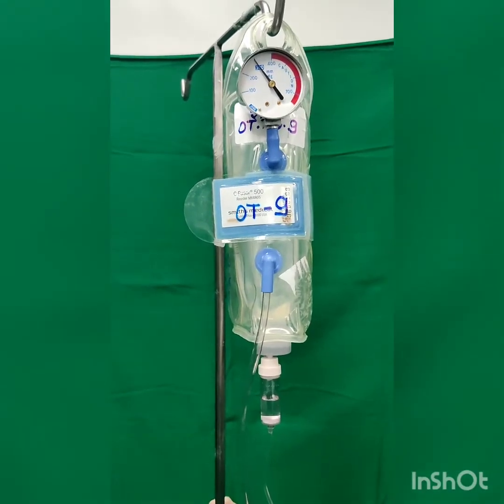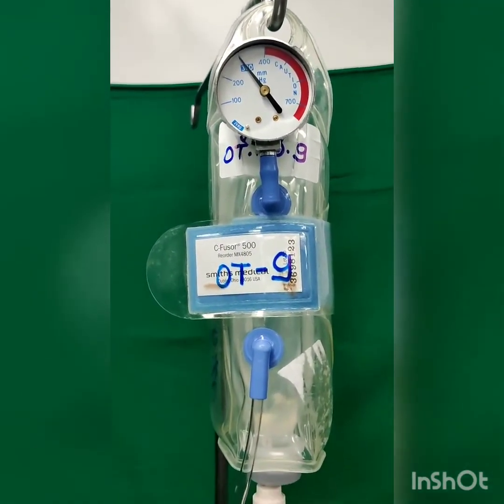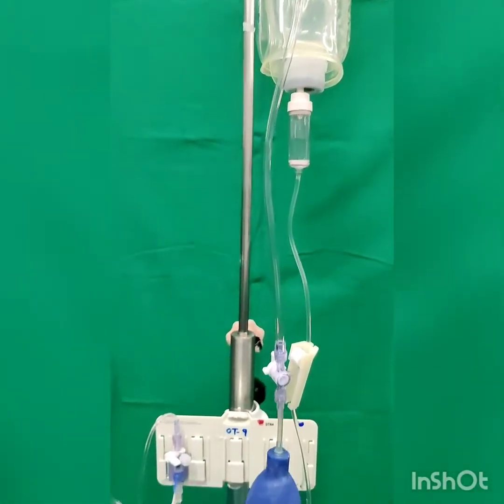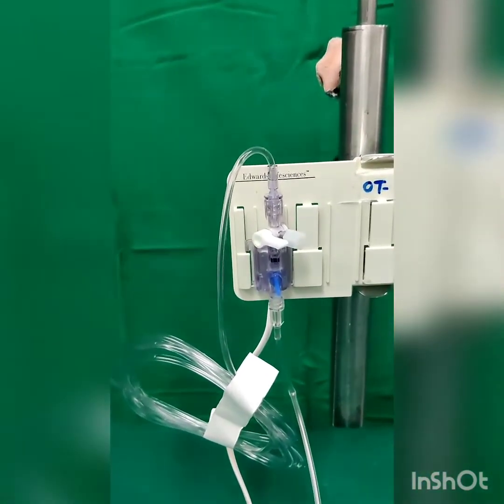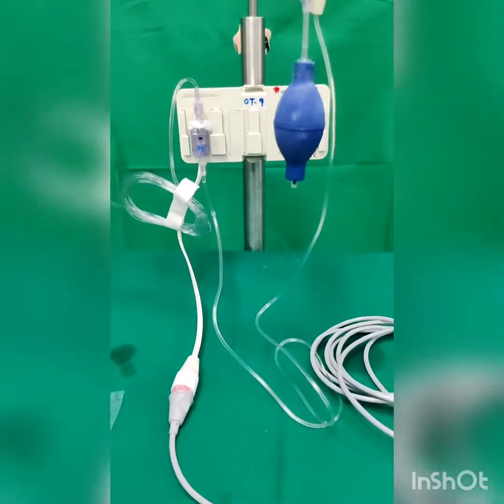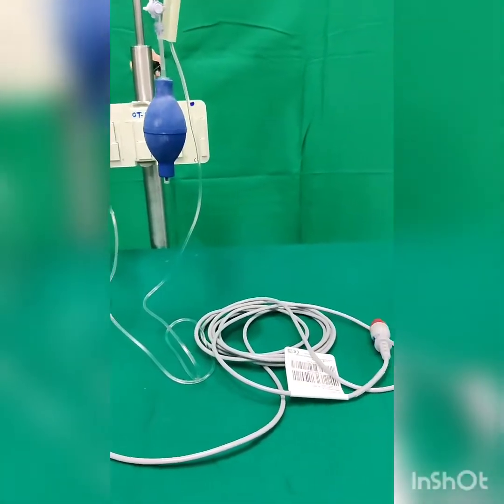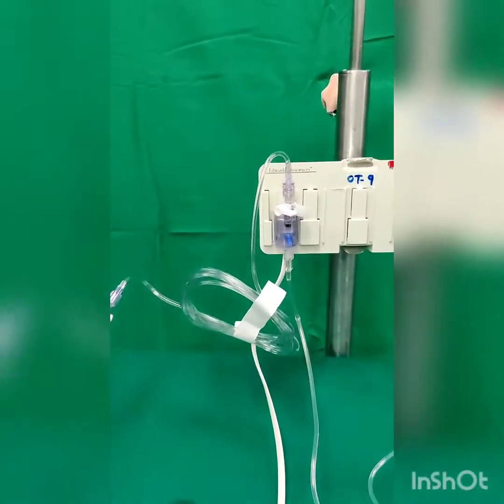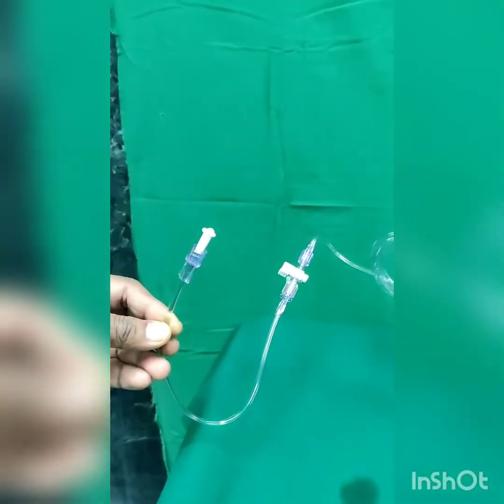The transducer setup has a 500cc normal saline bottle inside a pressure bag with a pressure of about 300 mmHg to prevent any backflow and to allow flushing of the catheter when needed. The pressurized normal saline bottle is connected via a flush tubing set to the transducer. The transducer is placed in a holder, connected at the lower end to the transducer cable which is hooked to the monitor, and at the upper end connected via flush tubing to the arterial catheter.